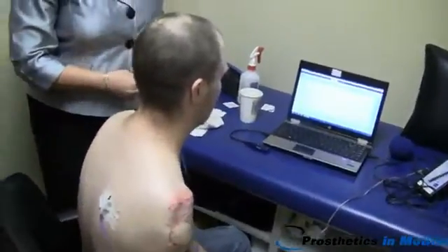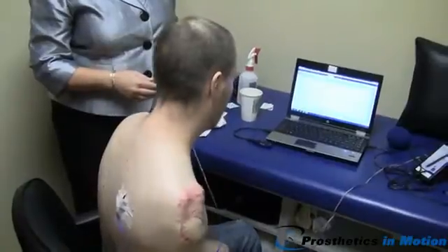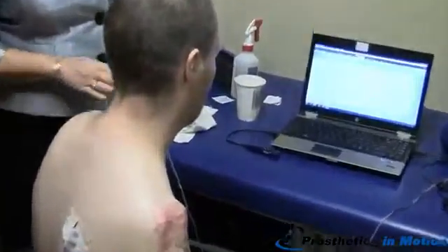So bringing forward — now go back. There you go. See the red spikes?